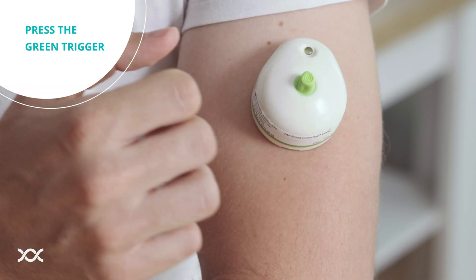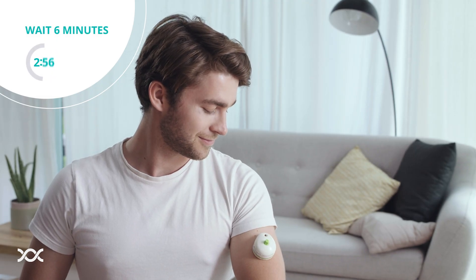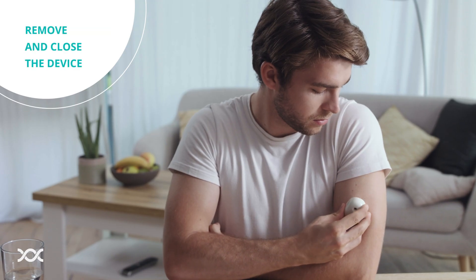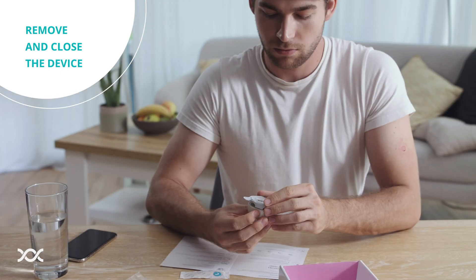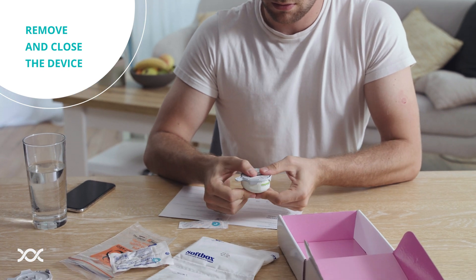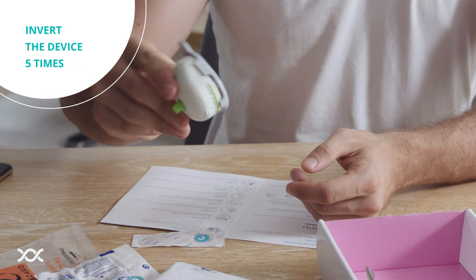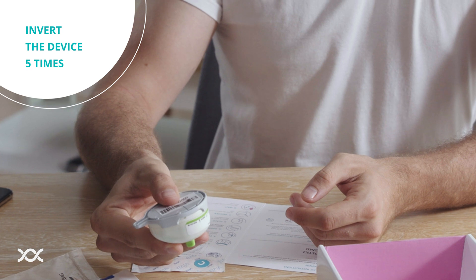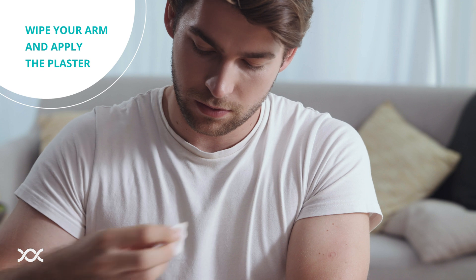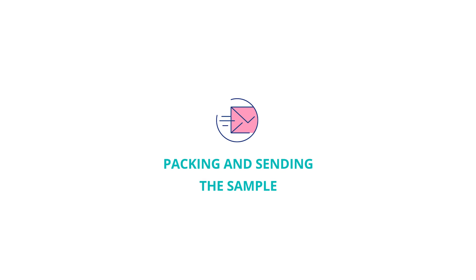You will hear a click, and the trigger will become soft. The collection usually takes 4 to 6 minutes. The process is complete when the clear view window turns red. Remove the device from your arm and cover it with the additional gray lid. Put the additional gray lid with the red rubber washer on the device, and make sure it has the barcode sticker. Gently invert the device 180 degrees five times immediately after blood collection. Wipe off any residual blood from your arm with the gauze. You can apply the plaster to the wound to protect your clothing from minor bleeding.